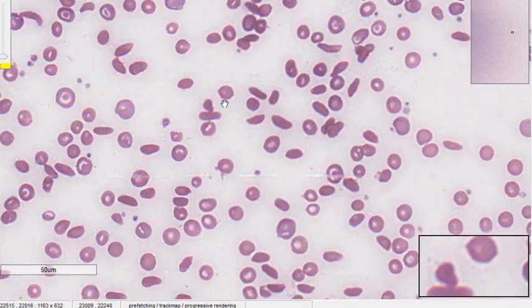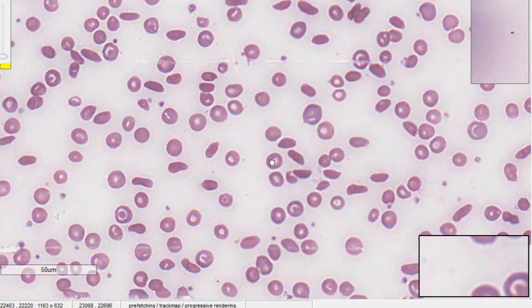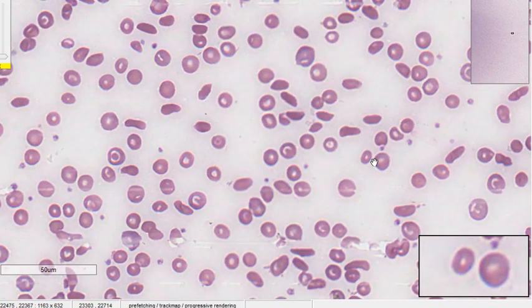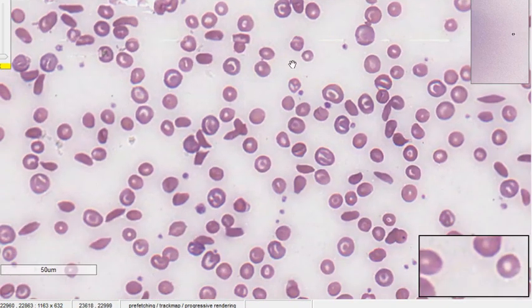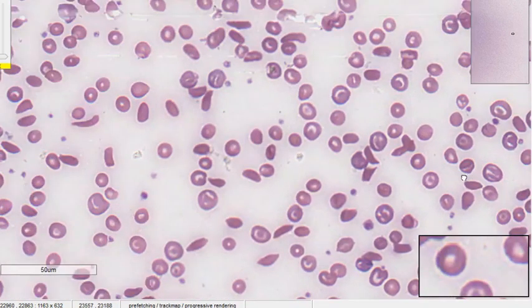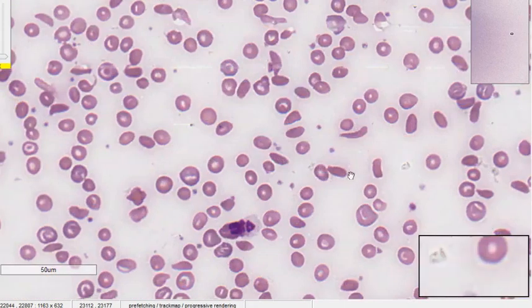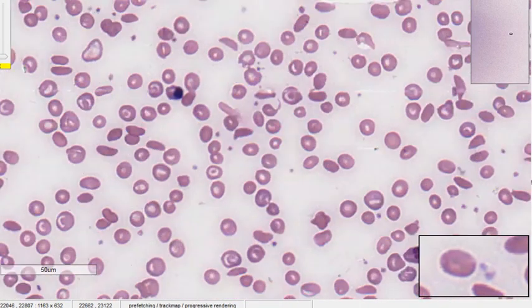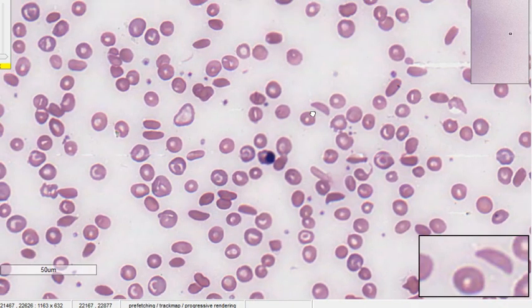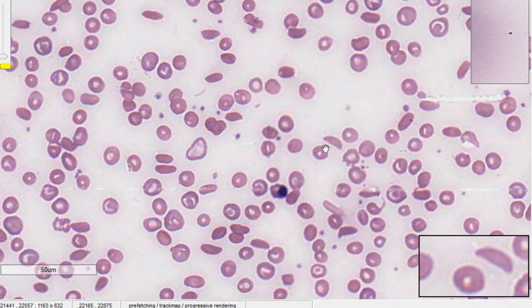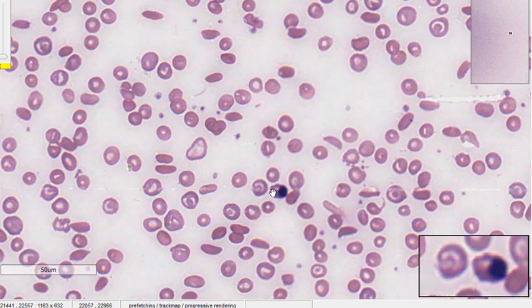The size of an RBC is compared with the nucleus of a small mature lymphocyte. If it is approximately equal to that nucleus, we call it normocytic. If it is smaller, we call it microcytic, and if larger, we call it macrocytic.